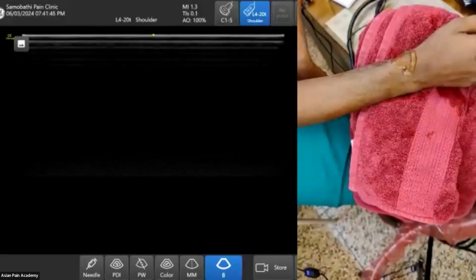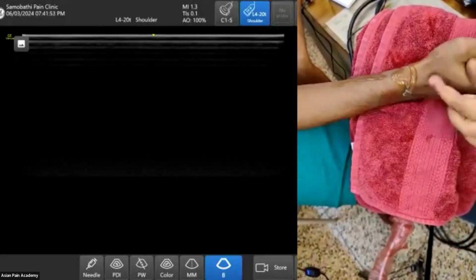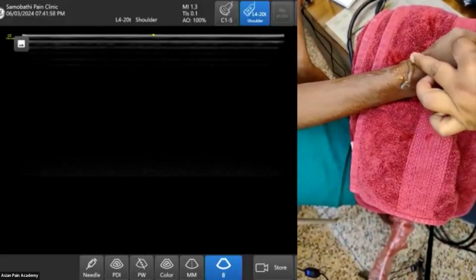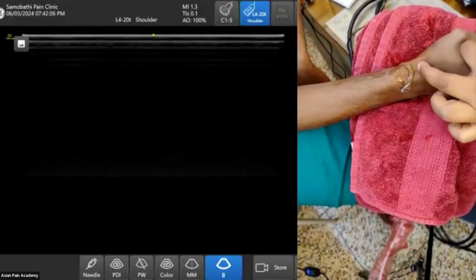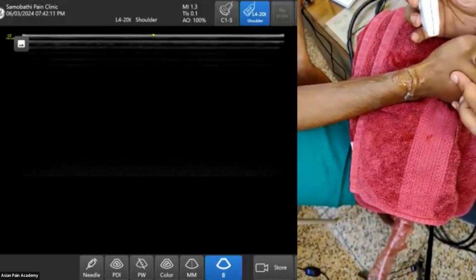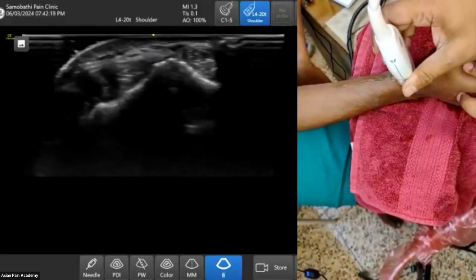This usually comes under the examination of the dorsal compartments. To make it easier, let me make the anatomical snuff box prominent. Here it is, the anatomical snuff box. On this side we get one compartment and here we get another. I am in a mid-prone position and we are following just above the tendon.